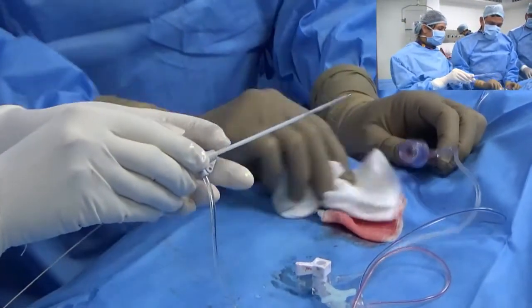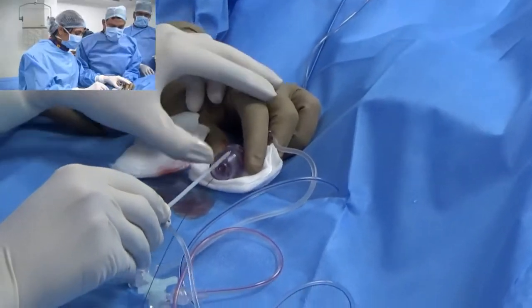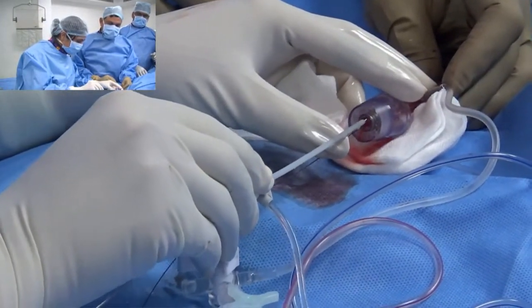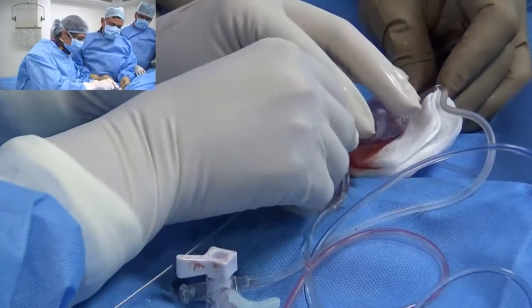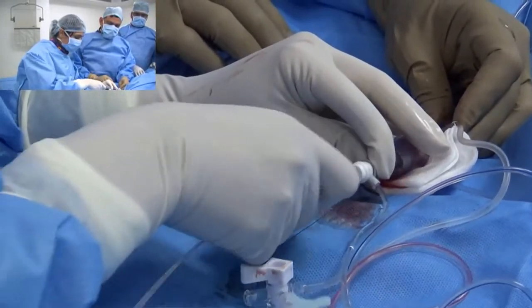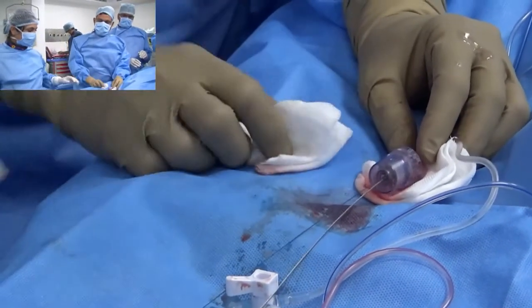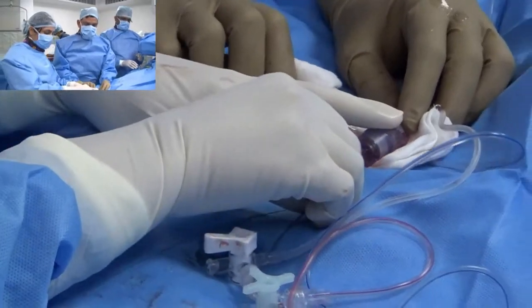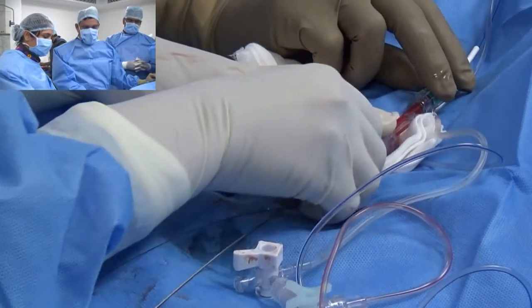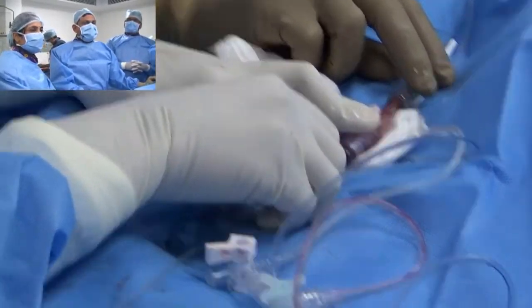What would have helped a little bit was to snare the buddy wire at the jugular vein. You would have had greater control in this situation. Yeah, that is also an ideal option, but the small wire snaring can be done. Oh, it's going easily. That's a good thing. That's the biggest advantage of your device, the profile. You can take it through guiding catheters, and that gives you tremendous flexibility in a number of situations, which is why I use it very often nowadays.